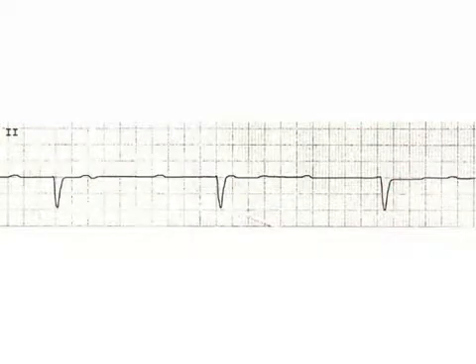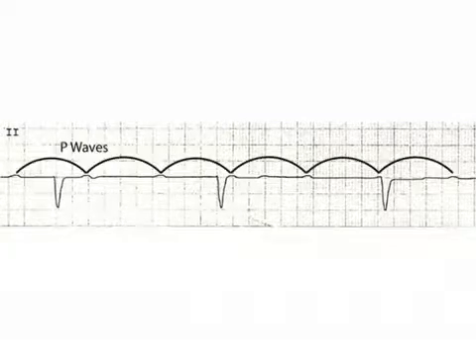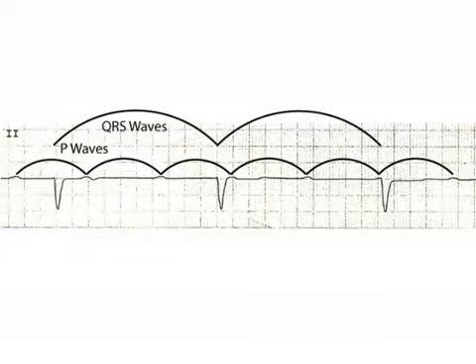And then the most serious block is the third degree. What happens here is the atrial rate is completely independent of the ventricular rate. As we look at the example and march out both the P waves and the QRS waves, there is no pattern between them. The P does not come in front of the QRS in any particular pattern or interval. They are completely independent, and that is the hallmark of the third degree block.